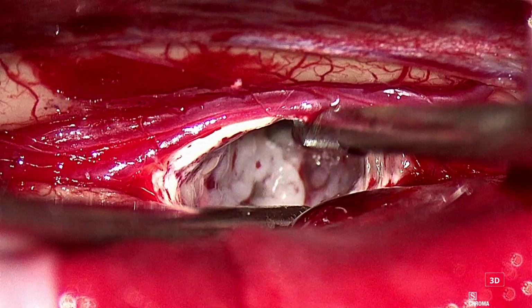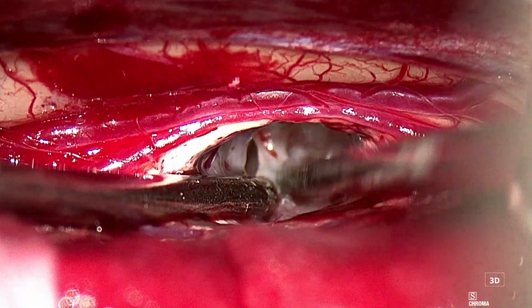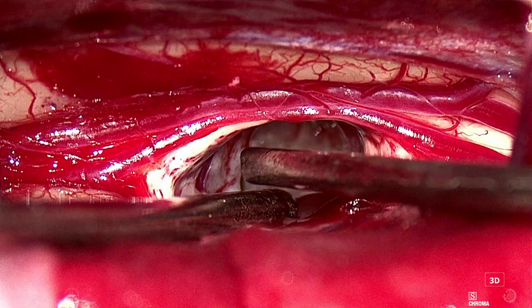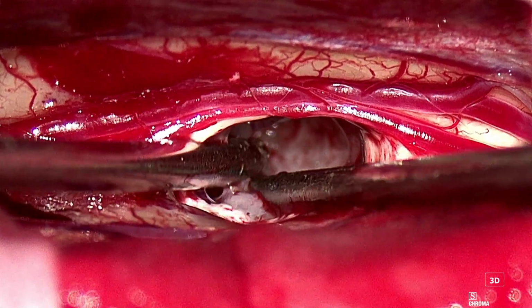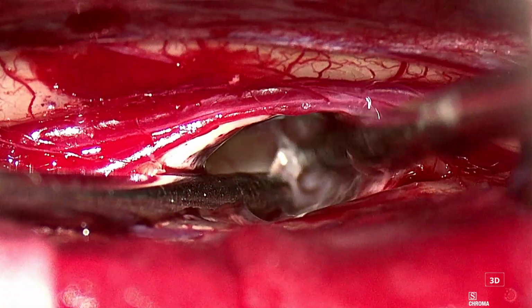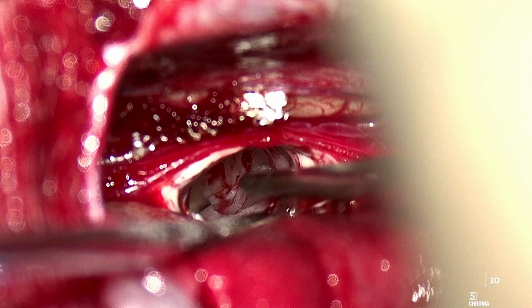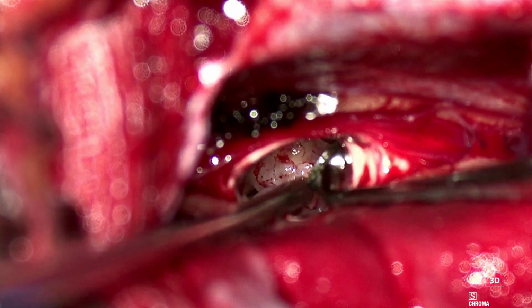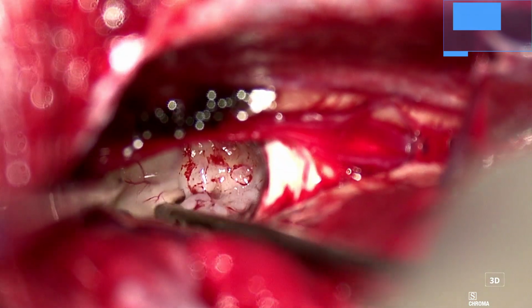The tumor was easily suckable. A curette was used to mobilize the parts hidden from our view. Here we see the foramen of Monro.